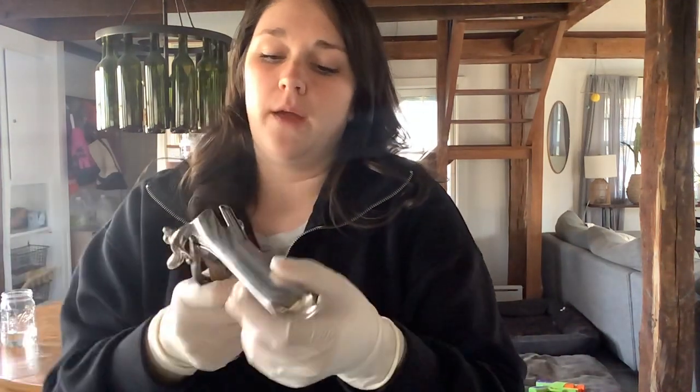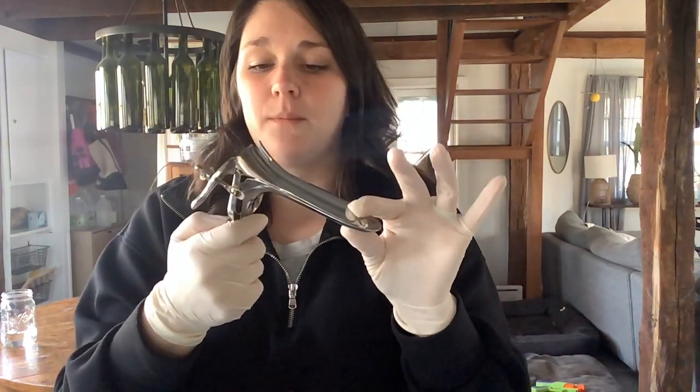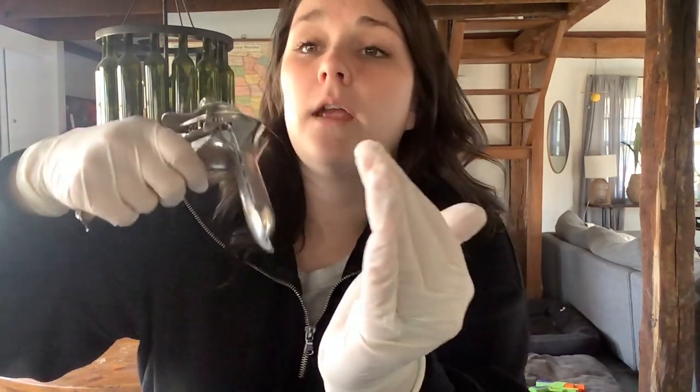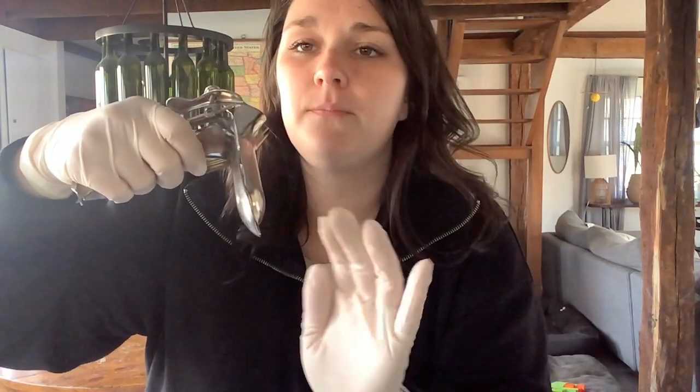So, okay, when I'm doing the speculum exam, my speculum needs to be closed. And I'm going to tell Olivia, whenever you're ready, you're going to feel the touch of my hand on your palm. And you're going to feel me inserting the speculum. So when I insert the speculum, tell me when you're ready. So she would say, ready.